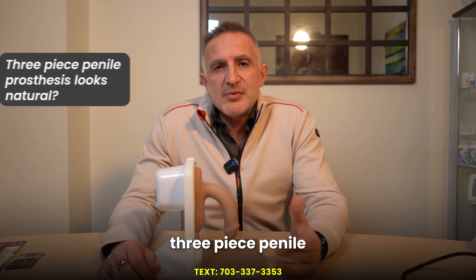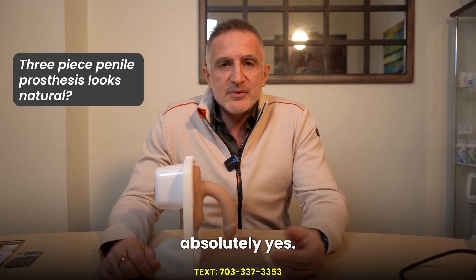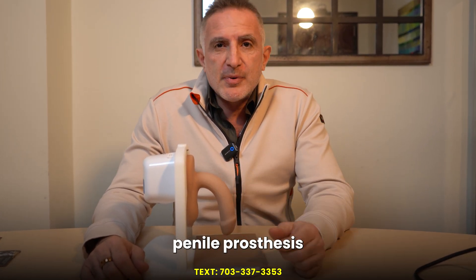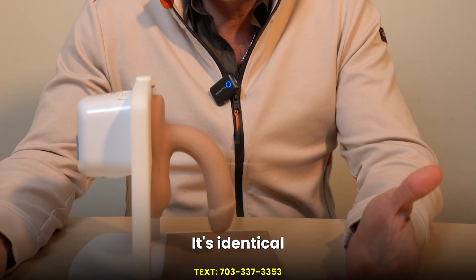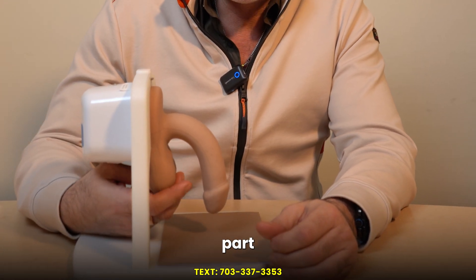A lot of patients want to know if the three-piece penile prosthesis looks natural. The answer is absolutely yes. This is an example of a three-piece penile prosthesis placed inside of this model of the penis. It looks and feels the same — it's identical to your own penis, and the pump is located at the lowest part of the scrotum.